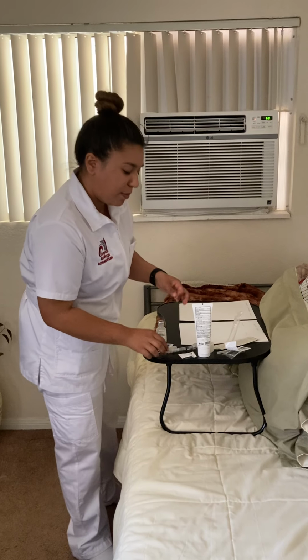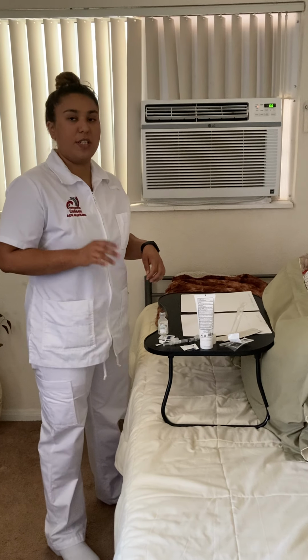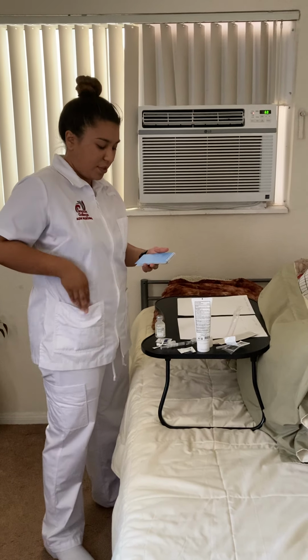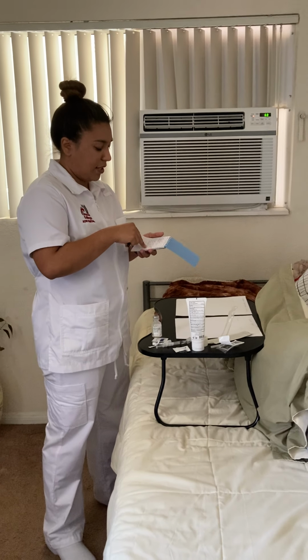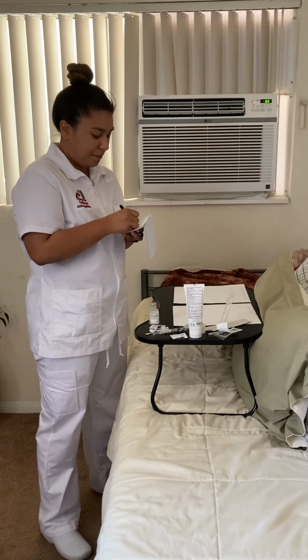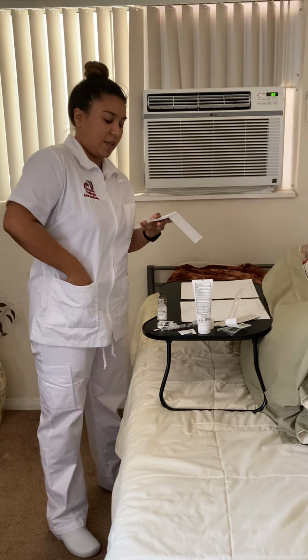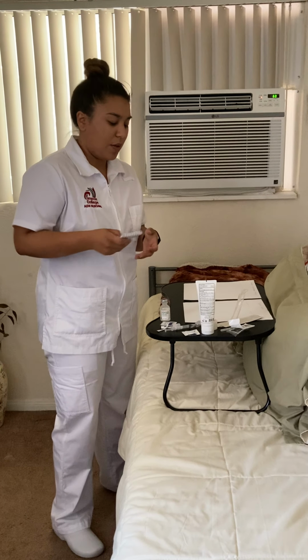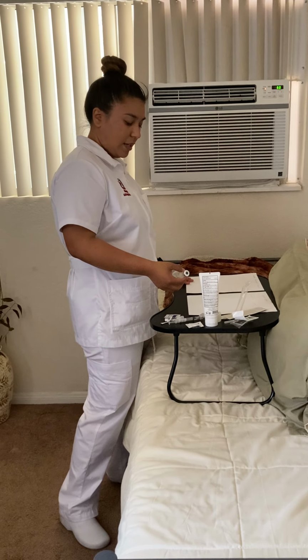I want to be mindful not to contaminate the needle and the syringe, and I'm going to go ahead and recheck my calculation by doing it one more time. So I would do the calculation one more time, and then so again it's the same as my previous one, so I can move forward. And this is also where I want to perform the second MAR check. Okay.